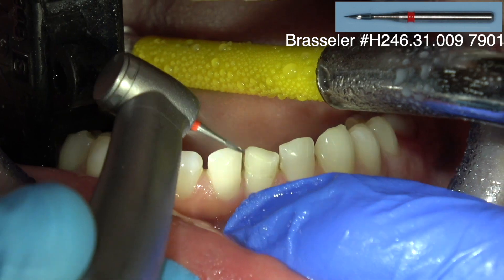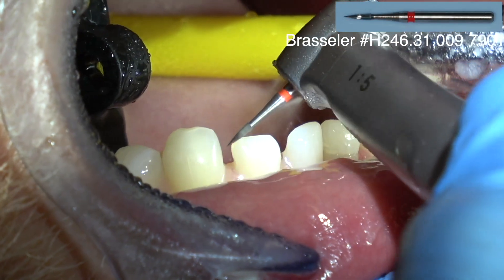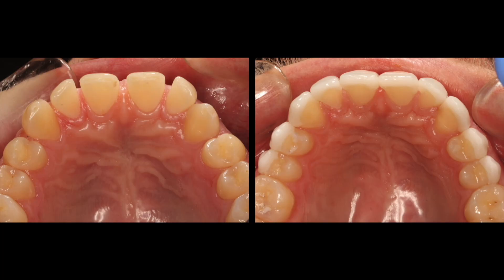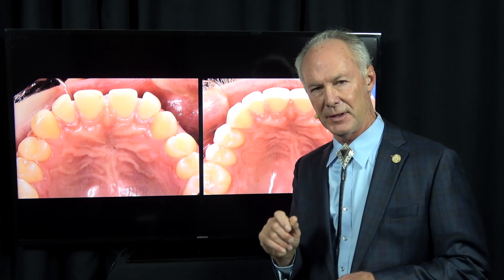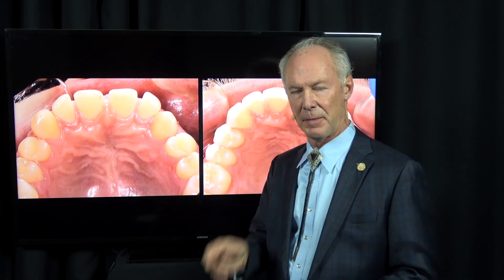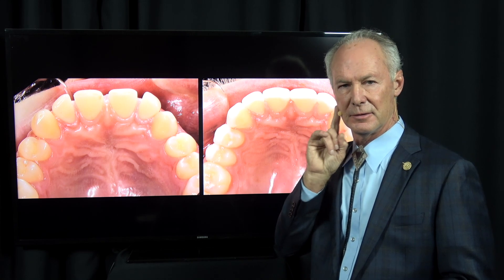Then I polish with a Shofu disc and a 12-fluted or 30-fluted carbide bur and check the occlusion. You don't want the four incisor teeth to contact hard — you want to be able to pull shim stock between the four anterior teeth in the alert feeding position when the patient's sitting straight up. The primary contacts should be from the cuspid to the mesial of the first molar. You don't want the second molar or the anterior teeth ever to be the first contacts.